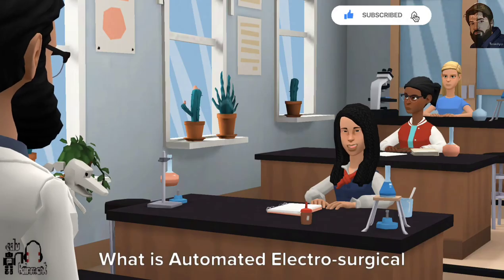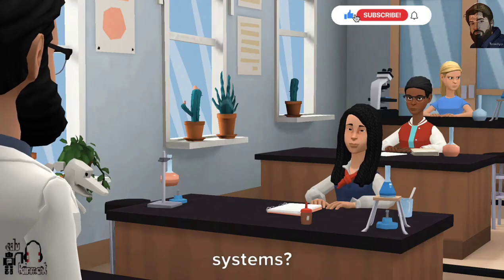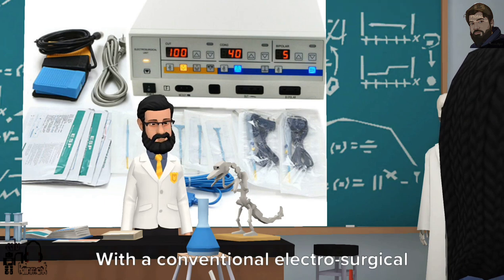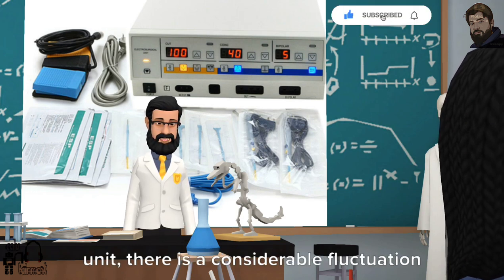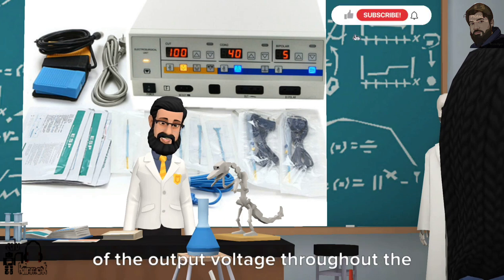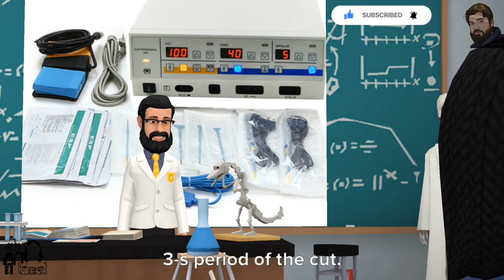What is automated electrosurgical systems? With a conventional electrosurgical unit, there is a considerable fluctuation of the output voltage throughout the 3 seconds period of the cut.